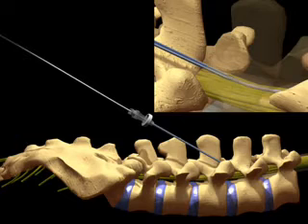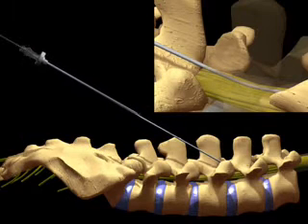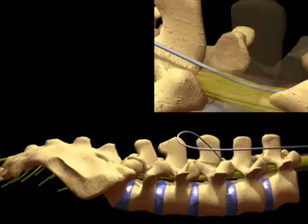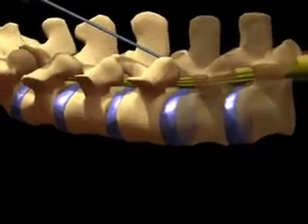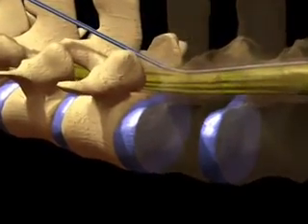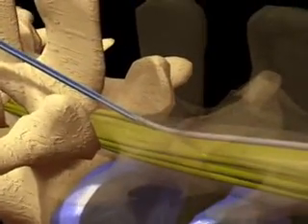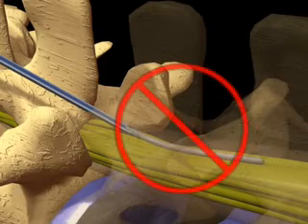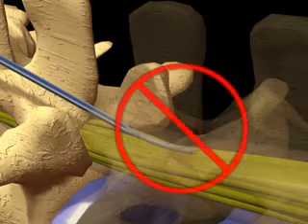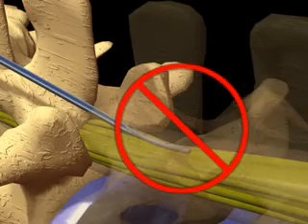Passage of the catheter through the paraspinous muscles for 1 to 1.5 vertebral levels before piercing the ligamentum flavum and dura may also help prevent catheter dislodgement from the spinal canal. Do not withdraw the catheter through the introducer needle. This can partially cut the catheter or completely shear off the catheter end. A partial cut can cause drug leakage, while a complete shear can leave a disconnected catheter segment in the intrathecal space.